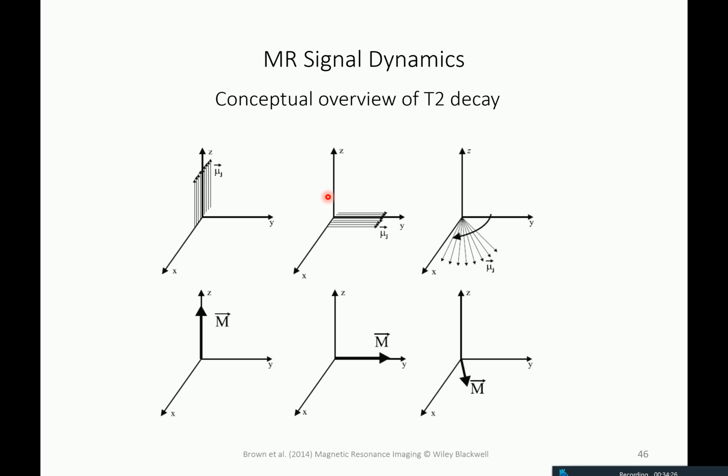That's another question. So the phase coherence is also by the excitation forces, not by the background magnetic fields? No, they have some. Yeah, it's by the excitation. For today, it's by the excitation. Okay, because there they start like this in the Z direction and are already in phase coherence. Yeah, that's true. So this happens before sometime? That happens at the time of the excitation. They are in phase, and then they go over.